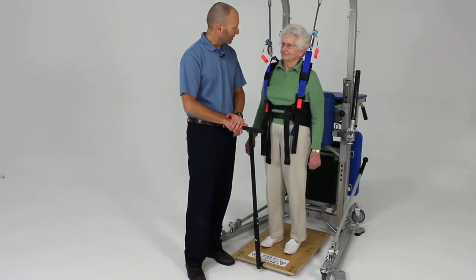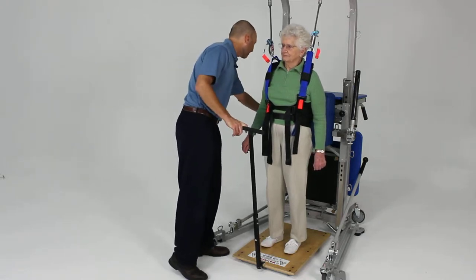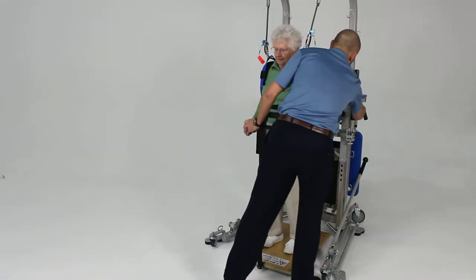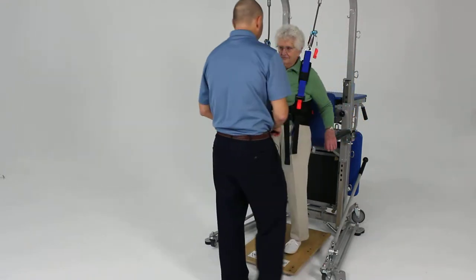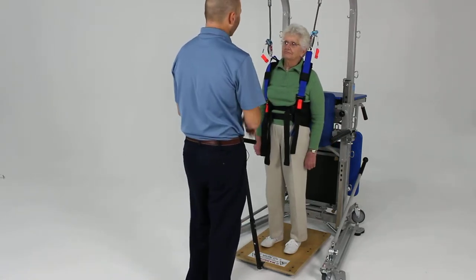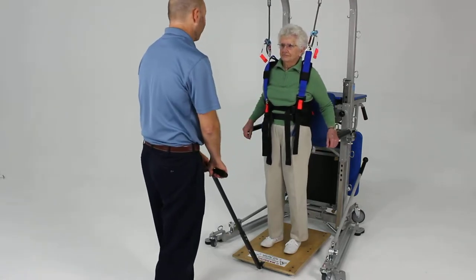Your job is just to keep your balance. I'm going to go ahead and put the armrests down so you have those for a little comfort to start with. But you don't get to hold on to them, so go ahead and take your hands off. Actually, hold on for a moment and I'll just let you feel what this is going to feel like.